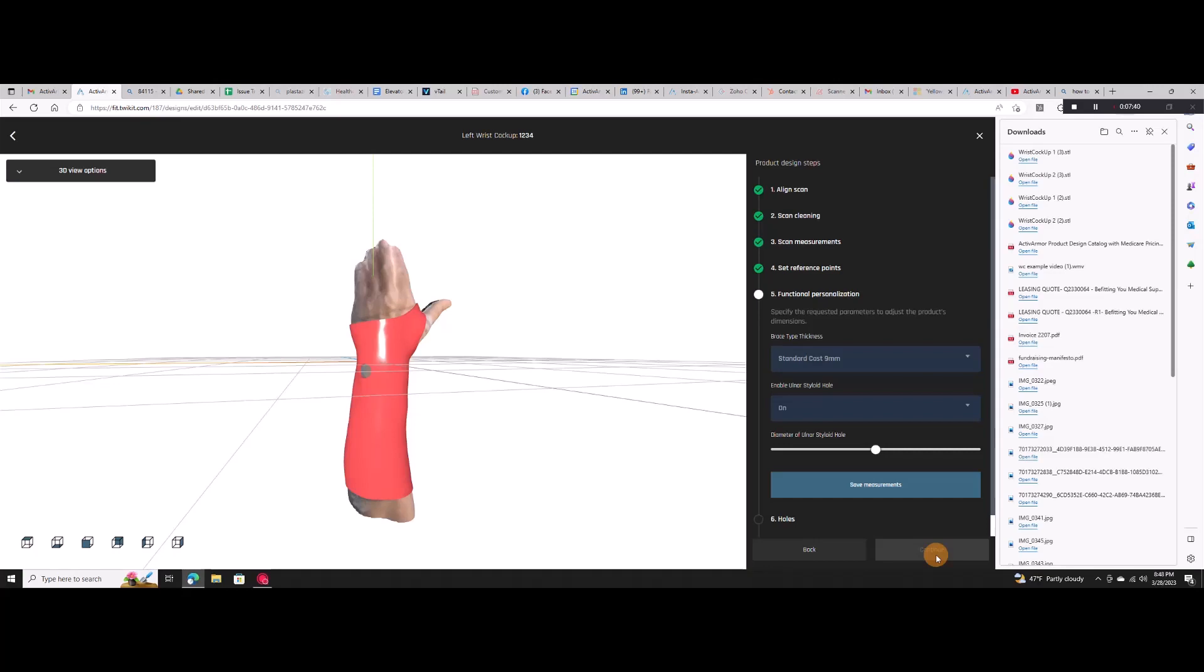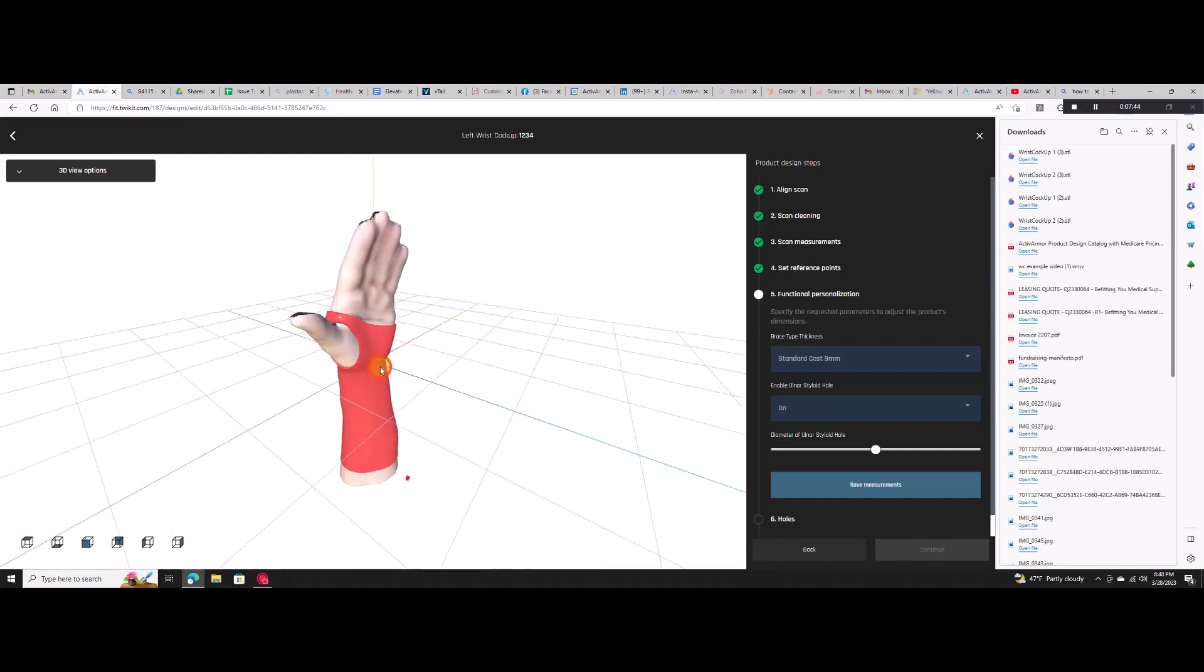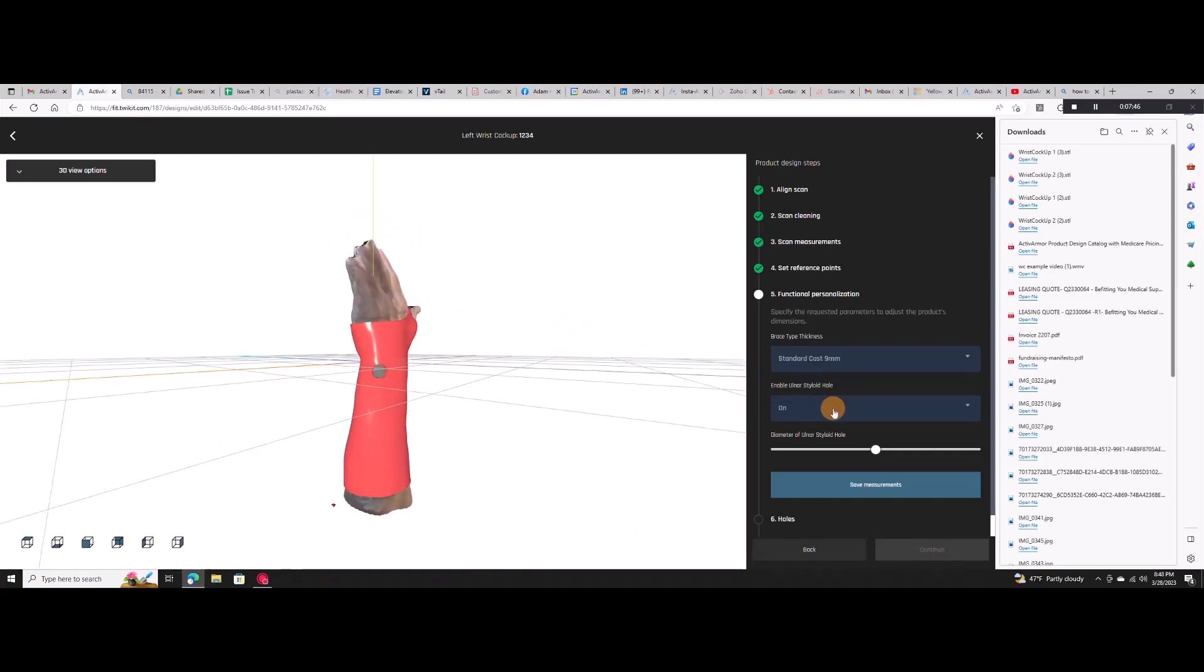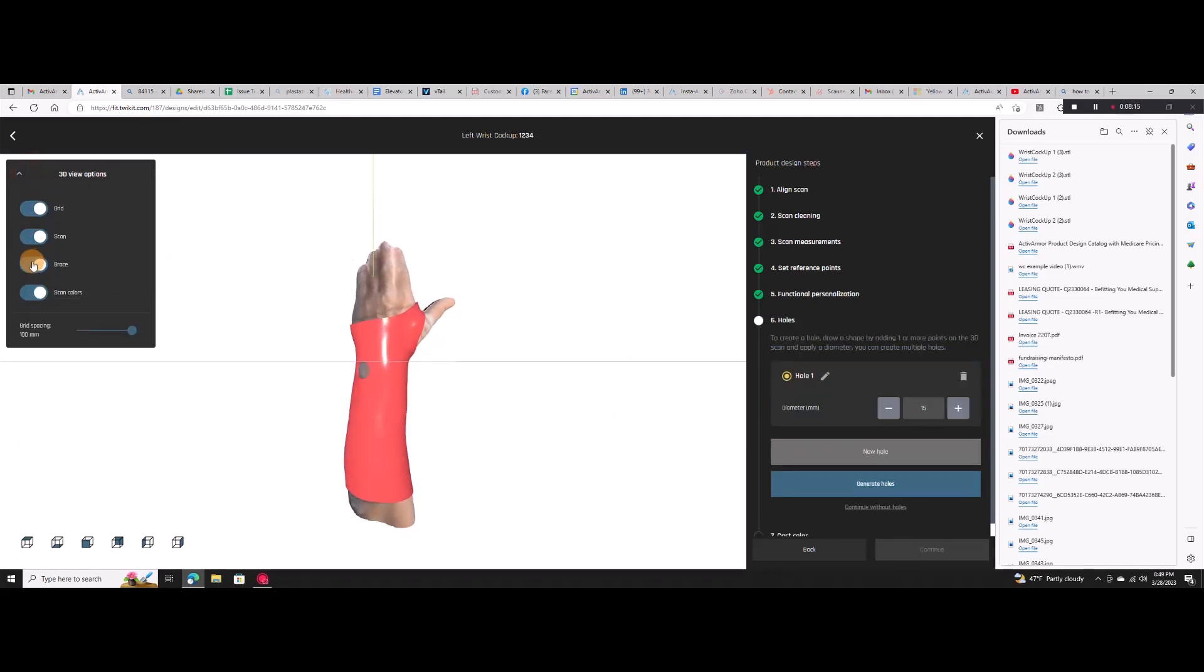You can go back at any time and make changes. Choose the size of the ulnar styloid hole and add any additional custom holes or offsets that you wish. You can turn off the brace visualization at any time to see the scan underneath and identify incisions or any markings.